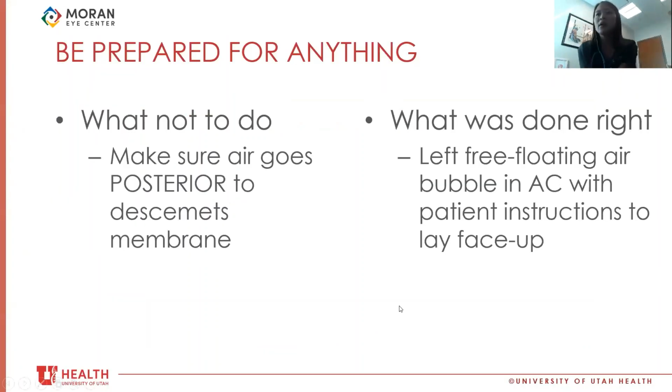Okay, so I kind of treated it like a post-DSEK case, which is having the patient lay face up for the rest of the day of surgery, and then all day of the following day. And then after 1 day post-op, they're allowed to go back to normal activities. So that was that case. Questions, comments? Anyone had this happen during surgery?